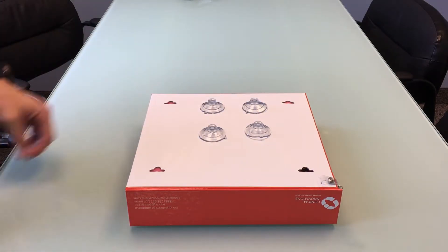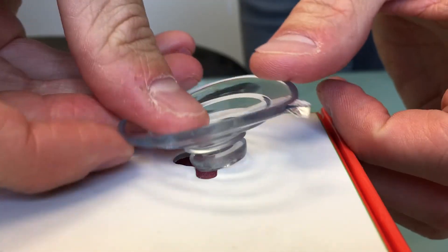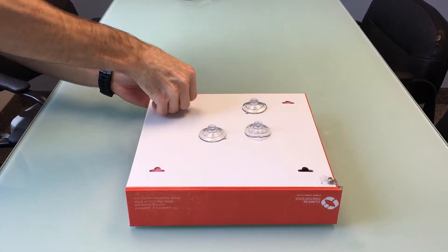Insert each suction cup by placing it in the hole on an angle, sliding it in, and then readjusting to the other side. Do this for all four suction cups.